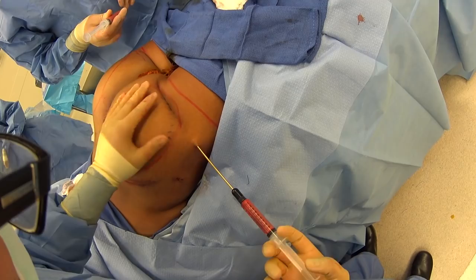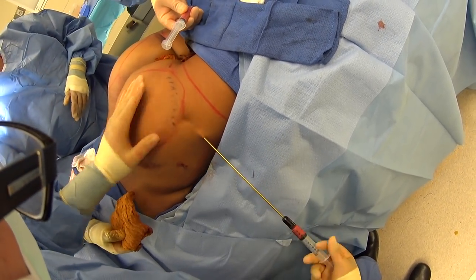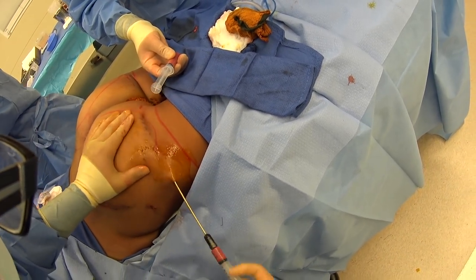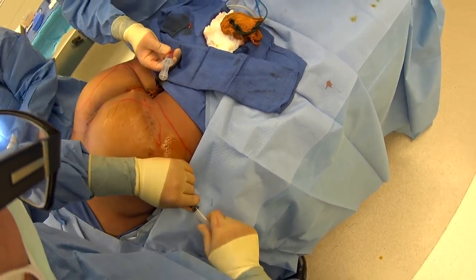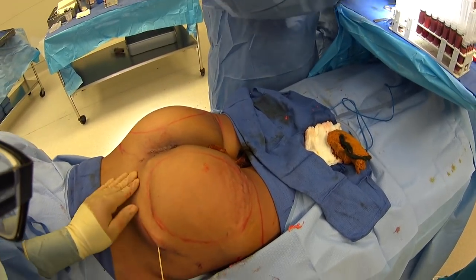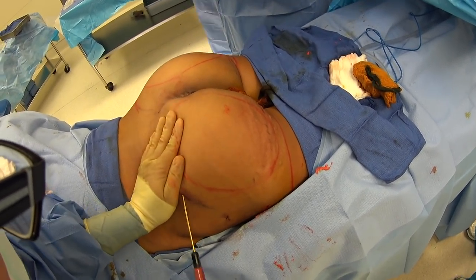We can keep the implants up high so that we can give her a lift and give her that great shape. And then we'll still round out the bottom part — now we fill the bottom — then come up around the top and just kind of fill out a little bit here, just to make a nice, great transition.